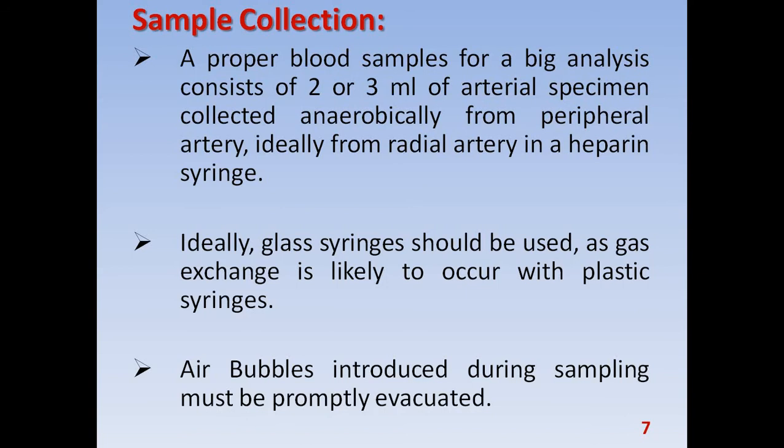But if the conversion of pallor to rubor, that is the pinkish color, takes a lot of time when we release the ulnar pressure, then we can conclude that there is some compromised blood flow in the hand due to compromised ulnar supply.